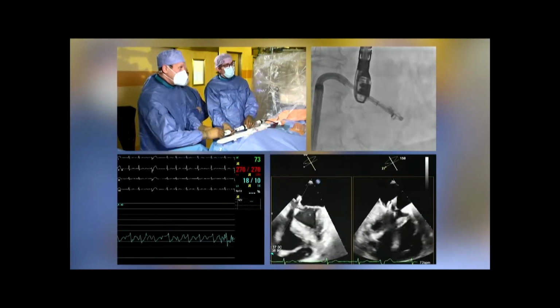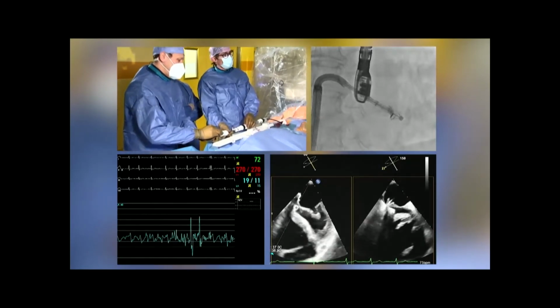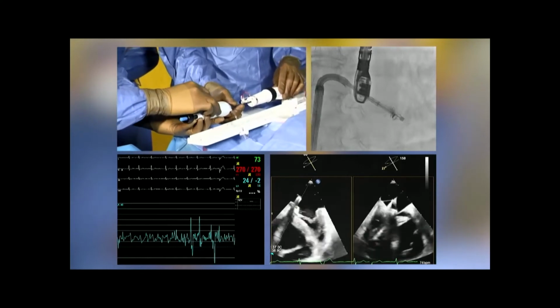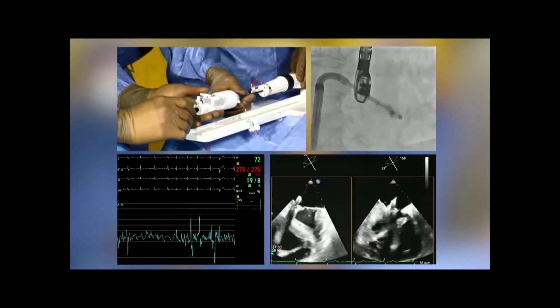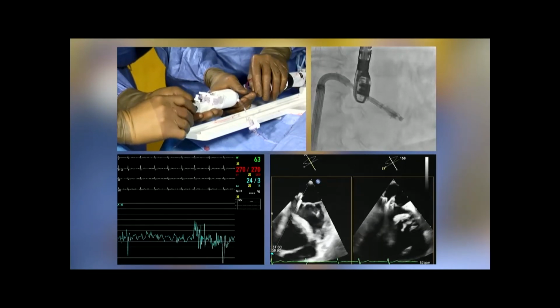Well, let's try that. Okay, let's bring them. Now we can do it simultaneously because they're very nicely on. So we bring down the clasps and we close the device and move in a little bit.